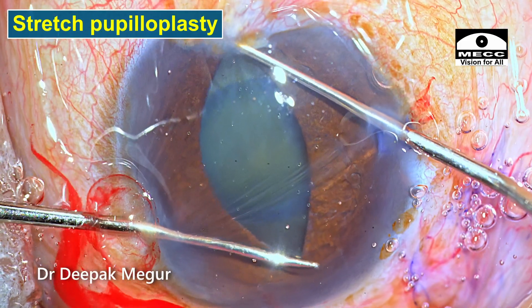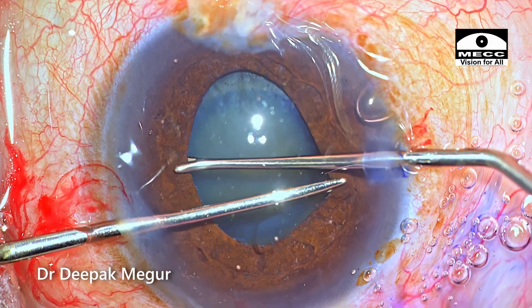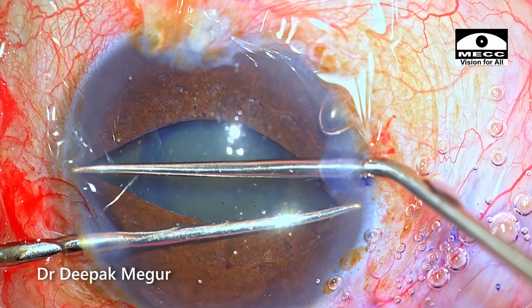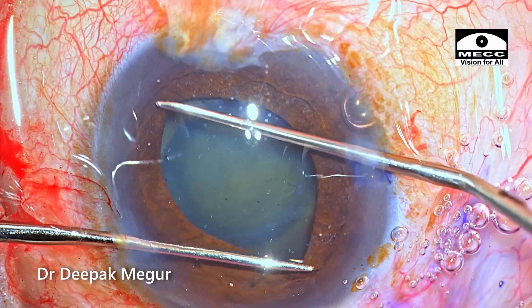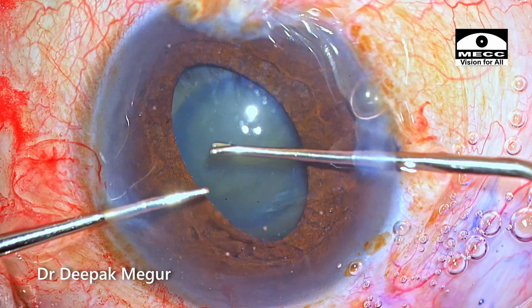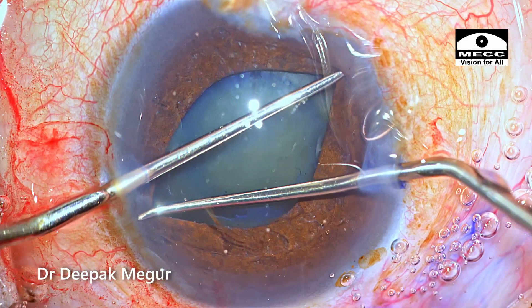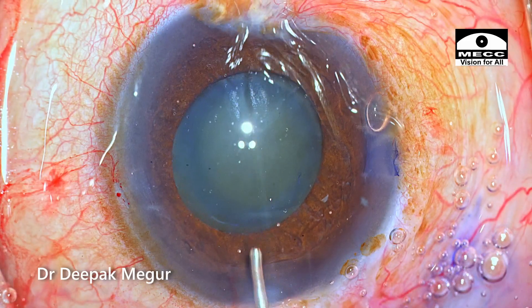Using two Y-hooks, the pupil is being stretched. I typically do this in four quadrants. In this case, I'm very conscious that the stretching is not extreme — it's just up to the mid-periphery and then stopped. I don't want the pupil sphincter to tear, so there is a little bit of moderation in the stretching, which will ensure that a sphincter tear does not happen and the pupil will remain regular and round.